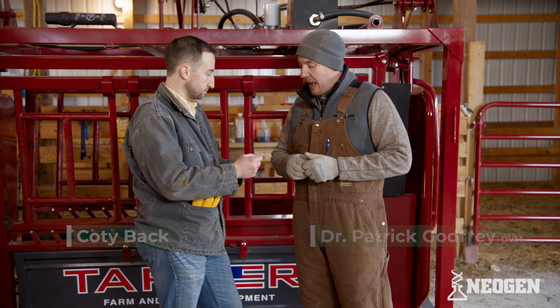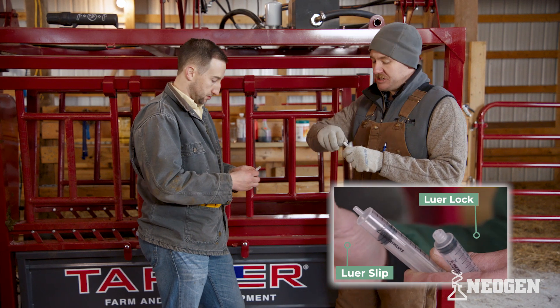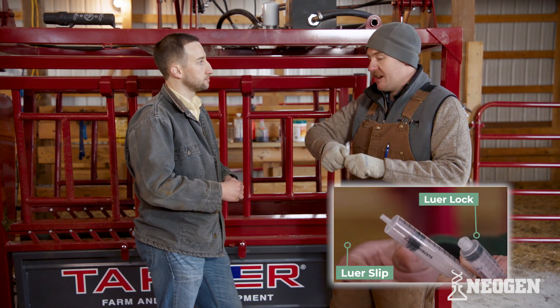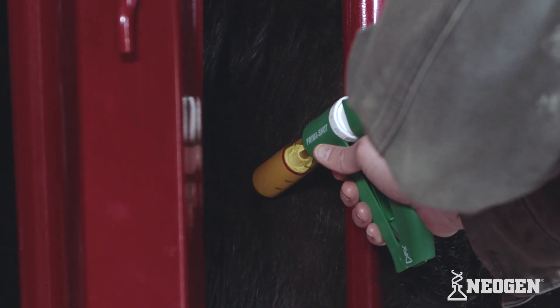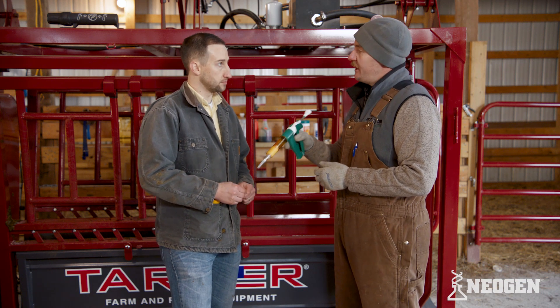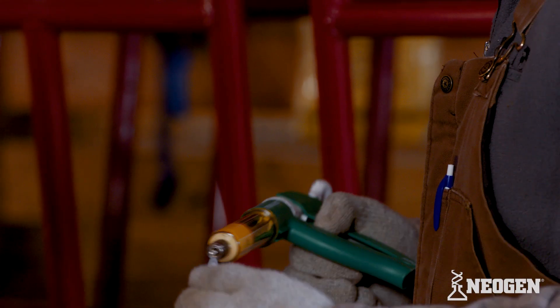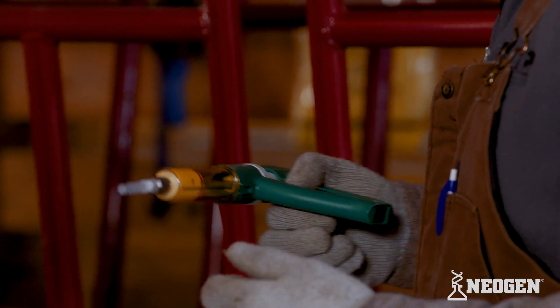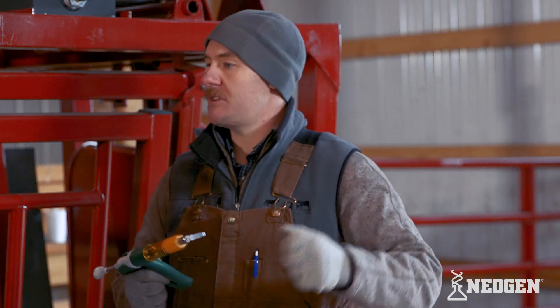The lock and the slip-on is when we talk about the syringe. We'll have syringes that you can actually screw the needle down into, like we have with our Prima shot that has a locking hub on here. So when we're in a situation where we're giving multiple injections, the needle does not slip off — you can screw the needle down in there and it doesn't pull off. Many times single-use syringes will have a slip-on end where the needle just slips on and slips off.